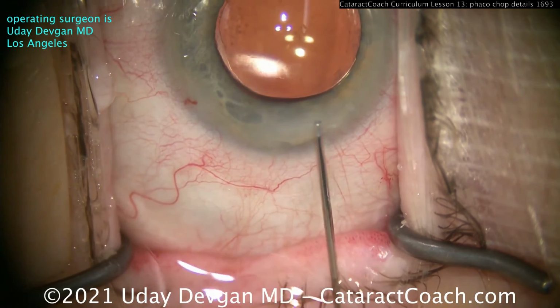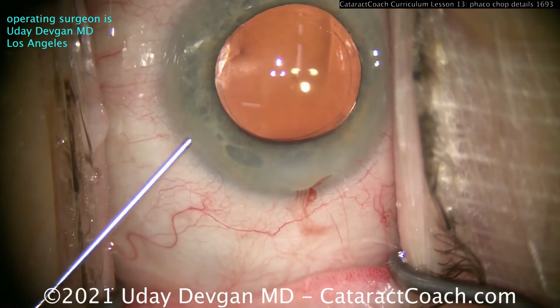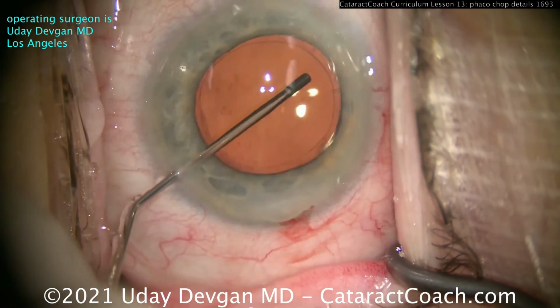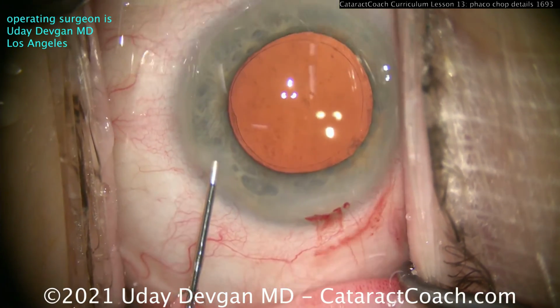So that looks great. Sealing up the incision the right way, not causing a ton of astigmatism, which you don't want to do. Notice how we don't whiten the side walls of the incision like an amateur. We're not amateurs here. We're professionals. And now angle sweep there to wash out any viscoelastic. Looks great.